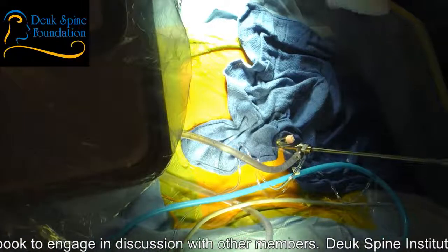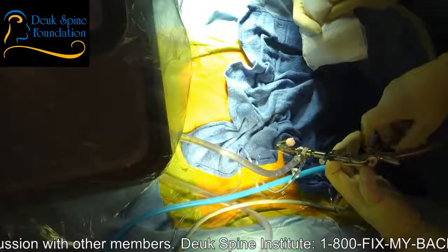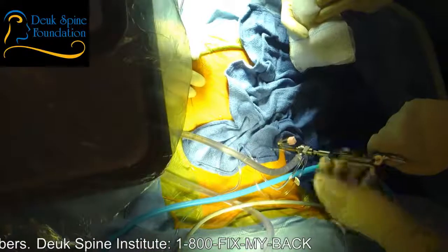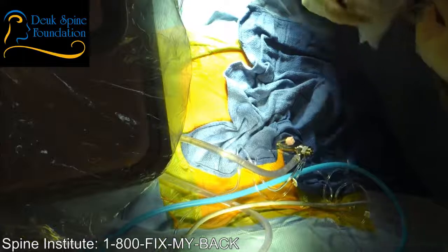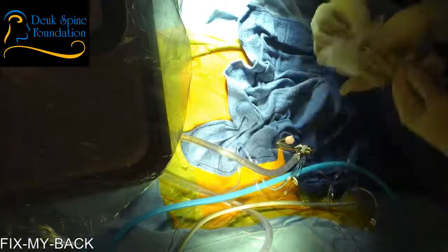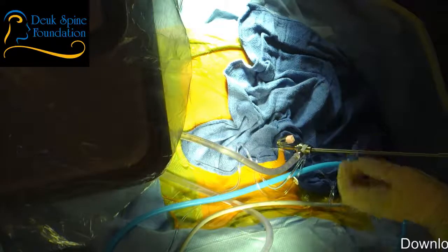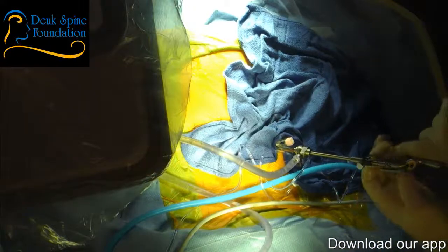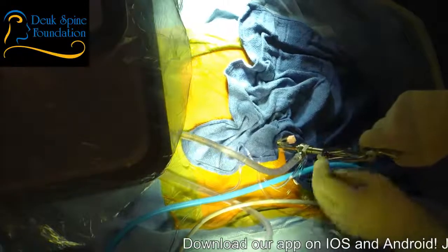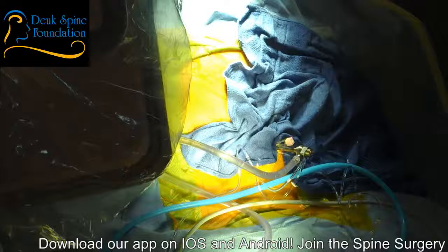There's a nice chunk. I don't want to put chunks back. The key is to shove in a piece of the towel and then pull the whole thing out nice and easy. You understand? You understand the words that are coming out of my mouth? Let's take a look at what we've done.